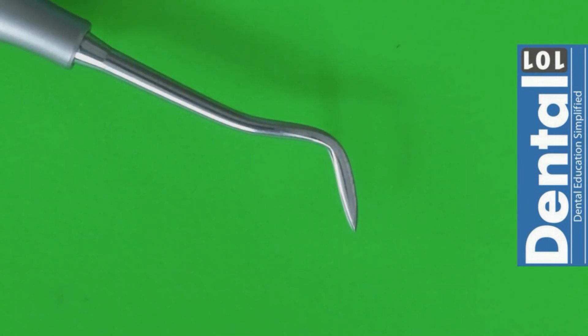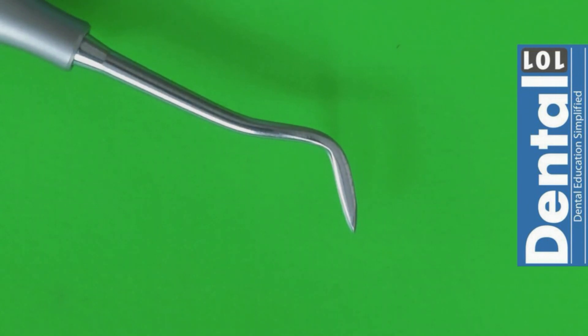Now we have the Hollenbach carver which is basically used to carve the occlusal anatomy of the amalgams, and sometimes you can even reach the interproximal spaces with this one while you are carving your amalgam as well.